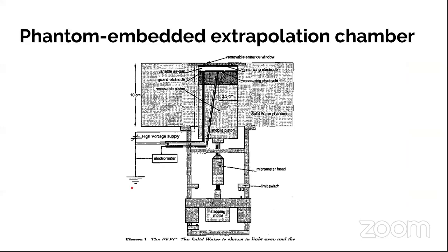This is a fun project. This is actually a chamber that we have used. My colleague, Corey Zankowski, designed it. He used it for calibration or absolute dose output. And during my PhD work, I used this design of chamber, but with some modifications.